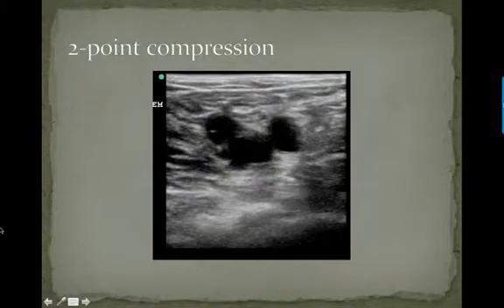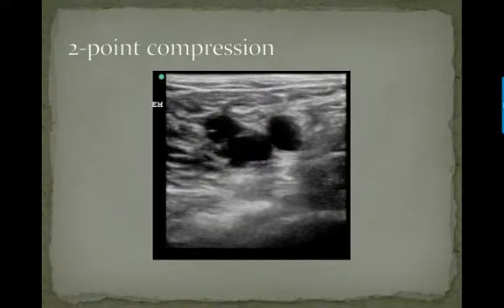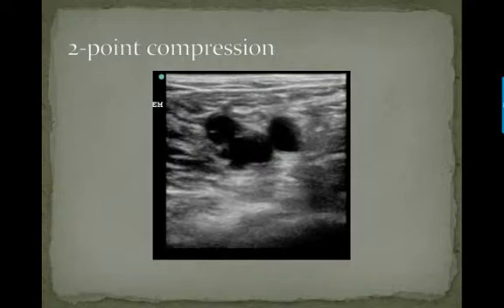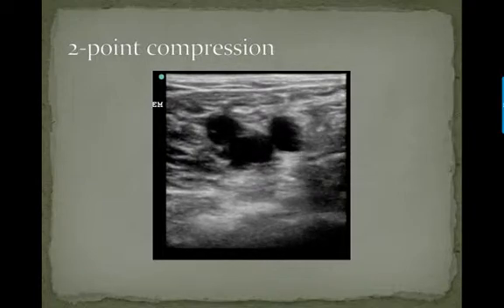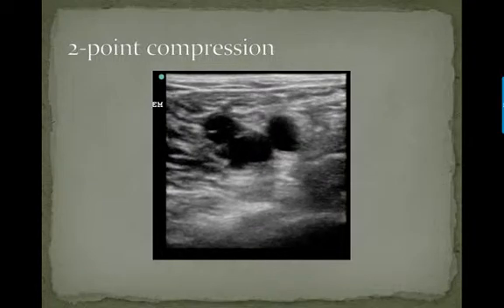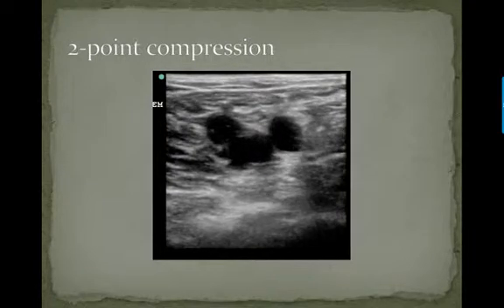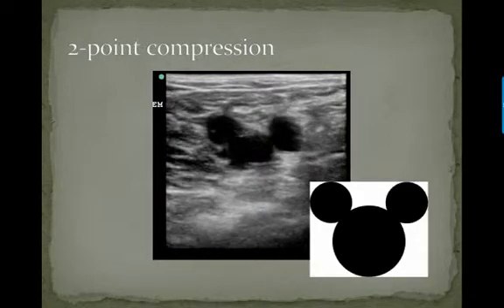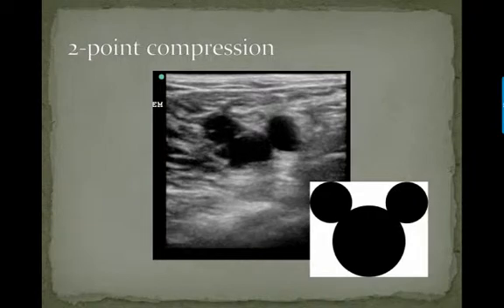Here's an example of the common femoral vessels by ultrasound. This is where the greater saphenous is joining the common femoral vein, and we can see the femoral artery. This triad is often said to resemble a Mickey Mouse head.